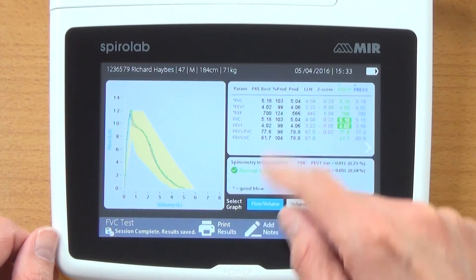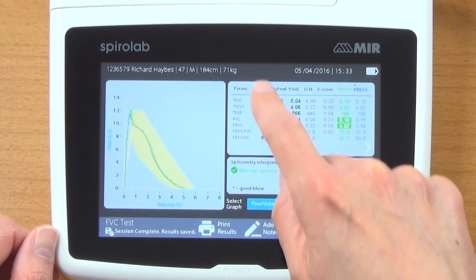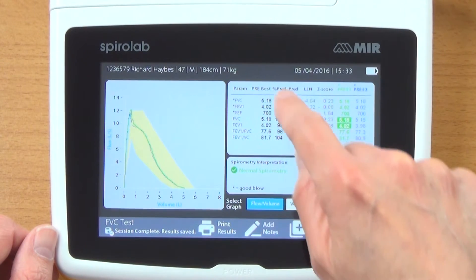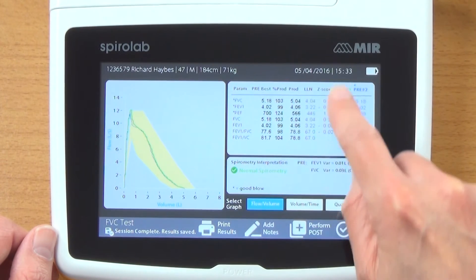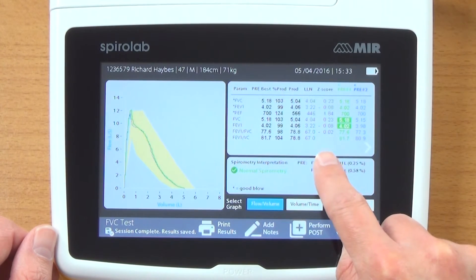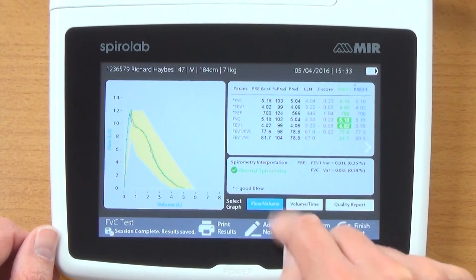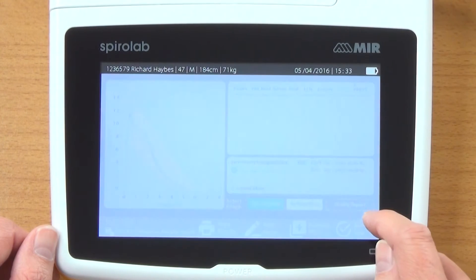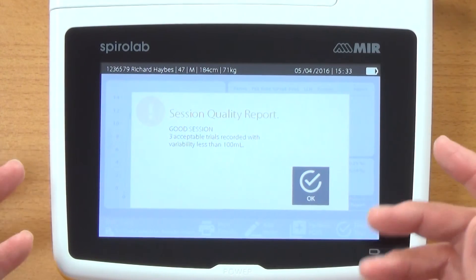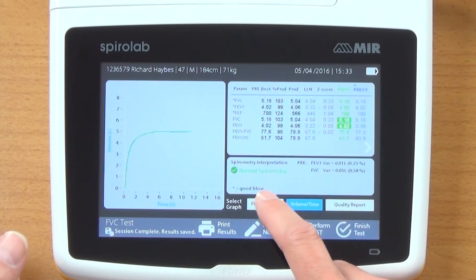We now get all the results up for that test. For my best test — pre-best — we can see all of the parameters. We get the percent predicted, the actual predicted, the lower level of normal, and also the Z score, which is really useful. You can see the variation on screen. The interpretation is normal spirometry. We can look at the quality report, which says it was a good session, and also look at the volume time graph.